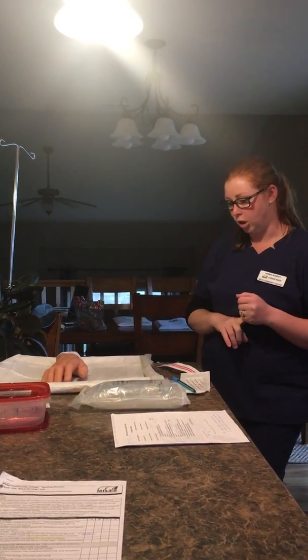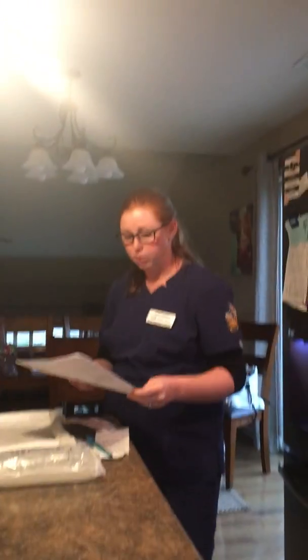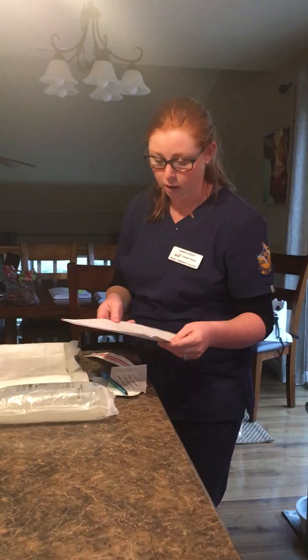So in order to get started, I'm going to first check my doctor's orders and the MAR. We have a doctor's order here for initiating an IV of 0.9% normal saline, 1,000 milliliters, and he would like it to be infused over 6 hours.